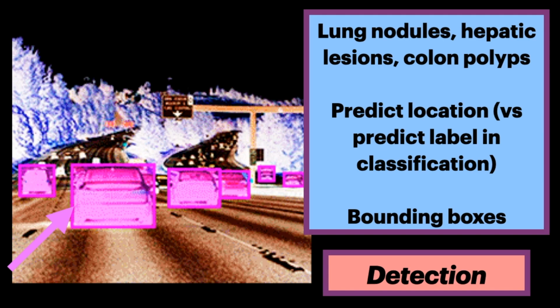It can be viewed as classification, where a predefined set of candidate patches sampled around points of interest are further classified as positive or negative. It can also be considered a segmentation task in which detection becomes implicit, as individual connected areas of the resulting mask are considered detected samples. Lastly, it can be considered a regression task, where the coordinates of bounding boxes outlining target objects are directly inferred from the input image, a technique broadly applied for natural images.